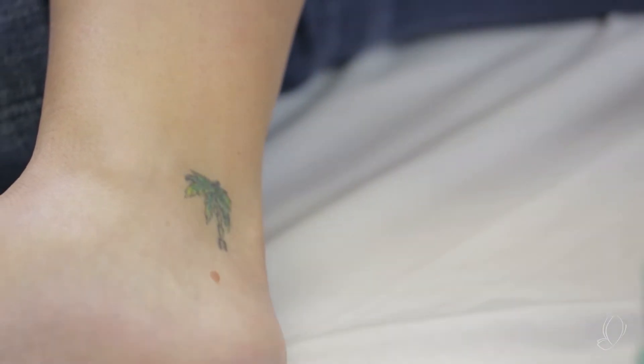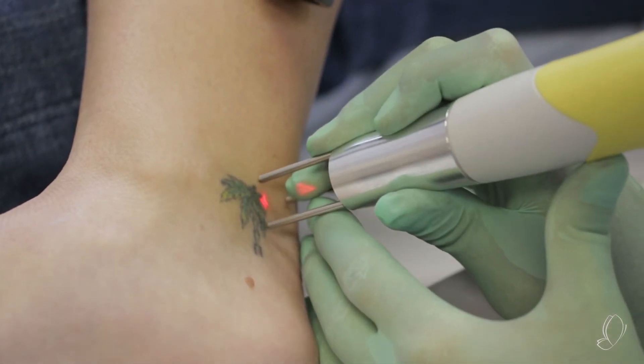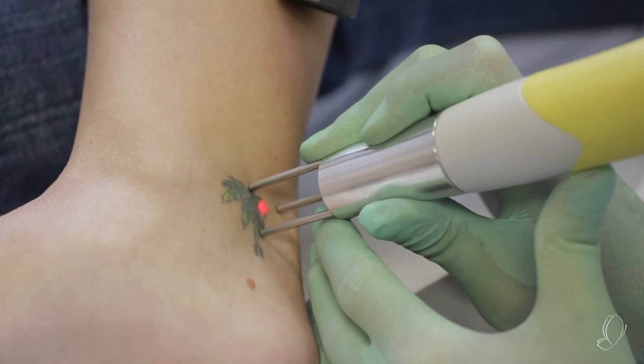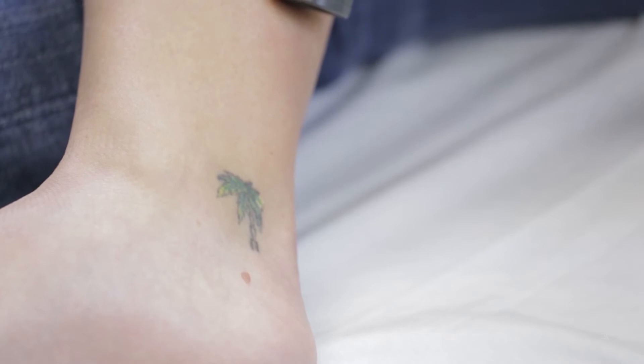All right, so we have this set up. We're using the 1064. We're going to do a test spot. We're going to try right here, perpendicular to skin, three, two, one. How is that? I can handle that. Okay.